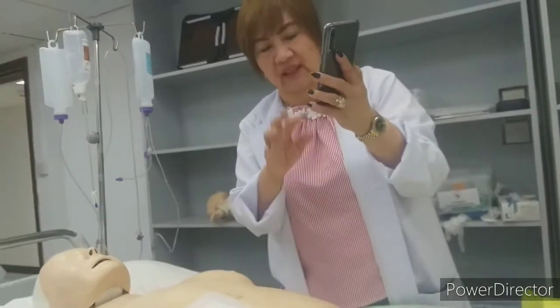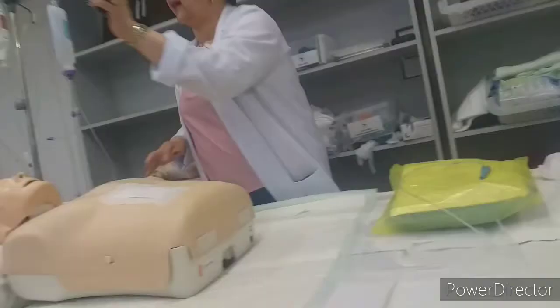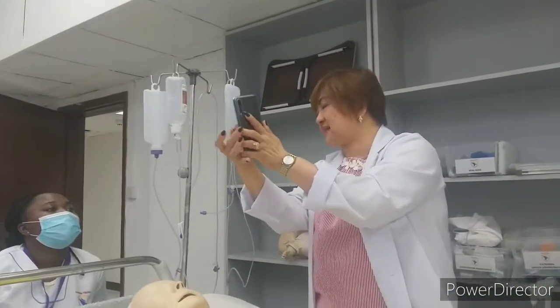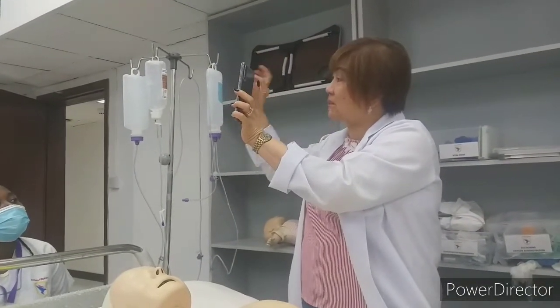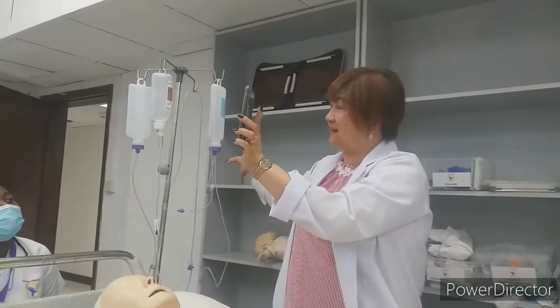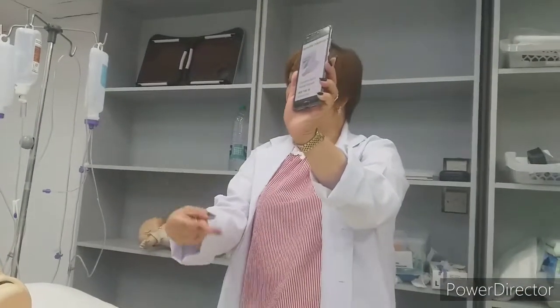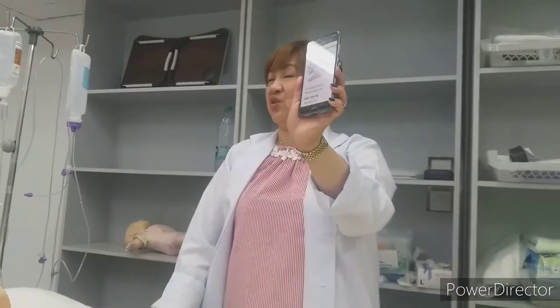You have to put it here, the colostomy bag. You see, there is no clip down here, it is round, so it is closed. Take it out and throw it. But if you have that down part with a clip, that is reusable.